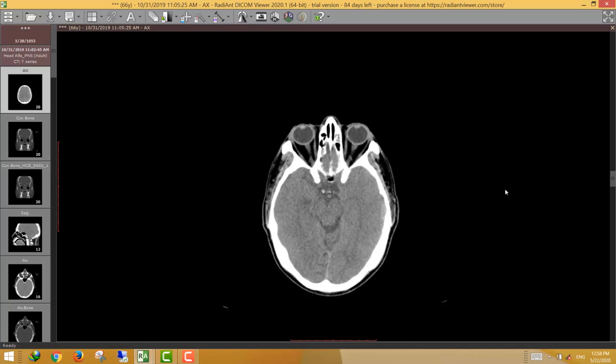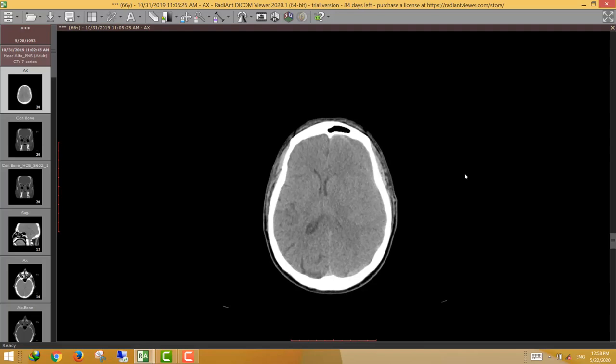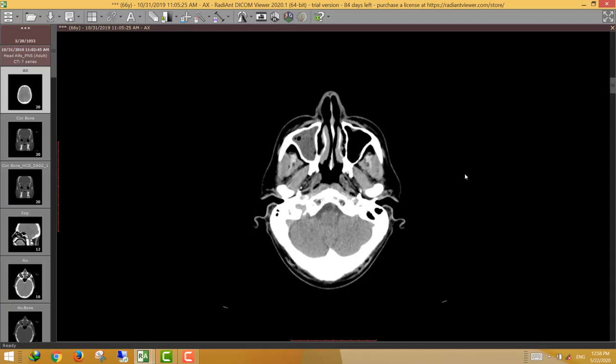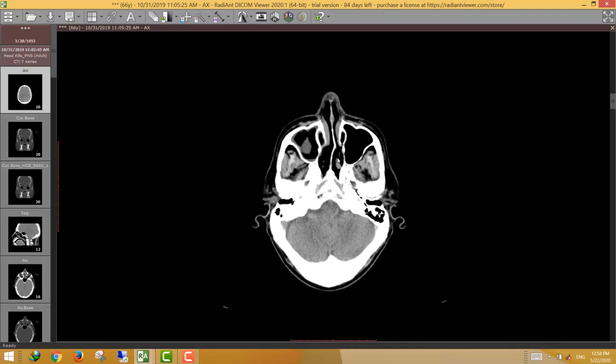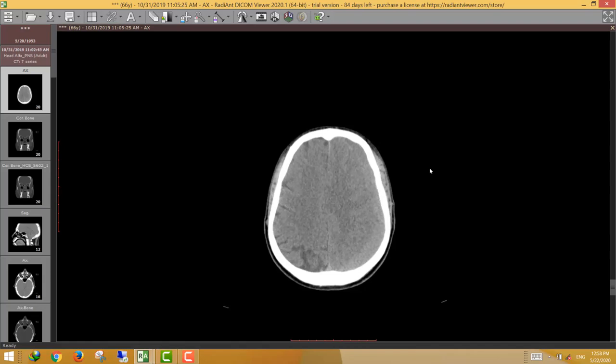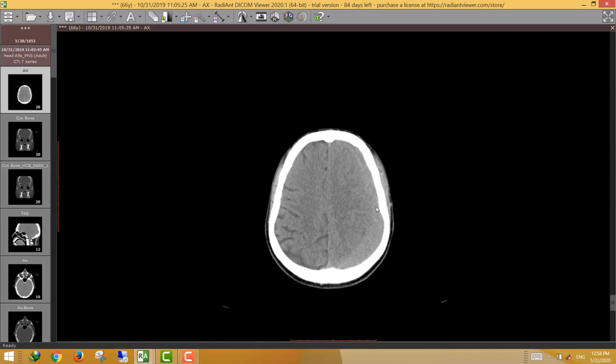Bismillah ar-Rahman ar-Rahim. Assalamu alaykum wa rahmatullahi wa barakatuh. Welcome to a new session of film reading pictures. As usual, we start with a neuro case. This is a 66-year-old male who came complaining of headache. He did a CT paranasal which revealed some opacification of the right maxillary sinus and ethmoidal air cells, but in the brain sections we instantly discovered lesions involving most of the left cerebral hemispheres.